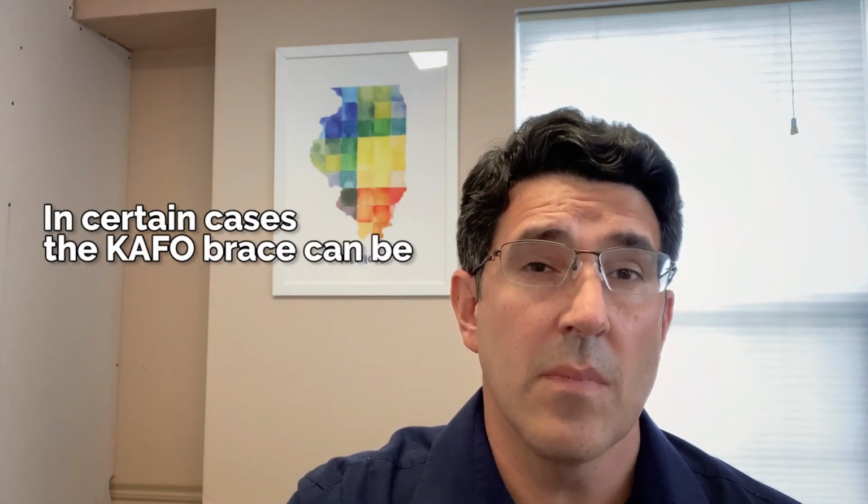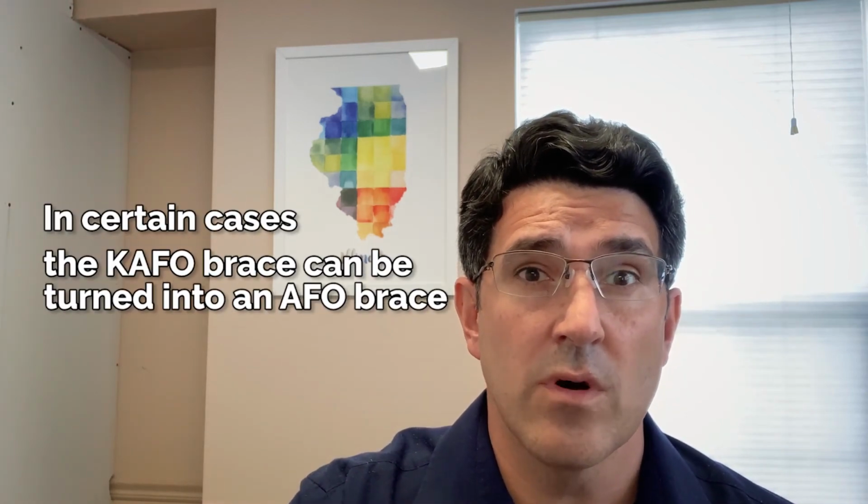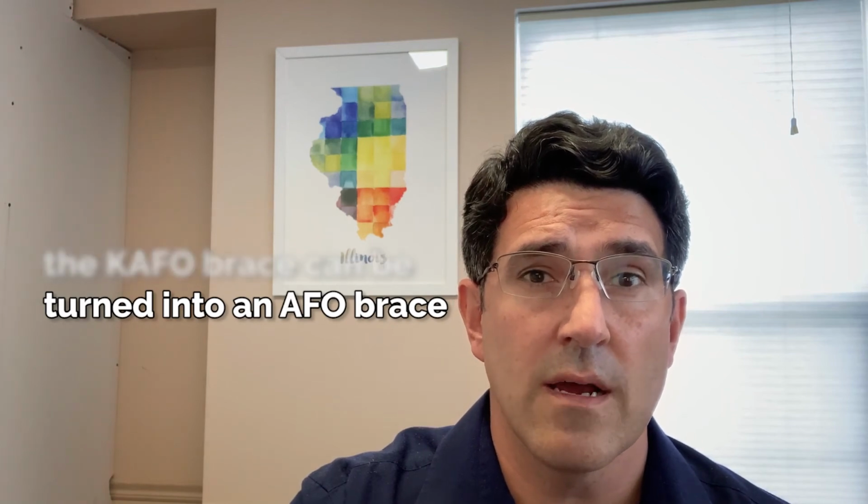Usually there's not an issue, but it is a little bit longer brace. You can also talk to your orthotist. If the KAFO just isn't working out, they can actually take off the top section in certain cases and make it into what's called an AFO brace that still has a lot of support and can indirectly support the knee, and you might be able to work with that if a larger brace isn't something that you particularly have grown fond of. You can try an AFO. But if your doctor wants you to have a KAFO, the whole team needs to talk on that then.